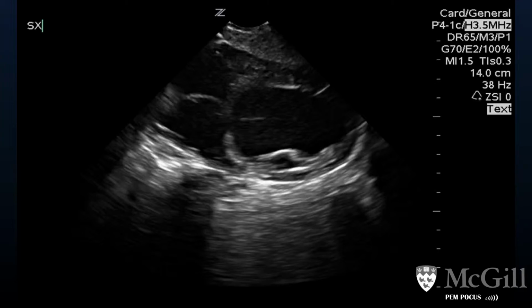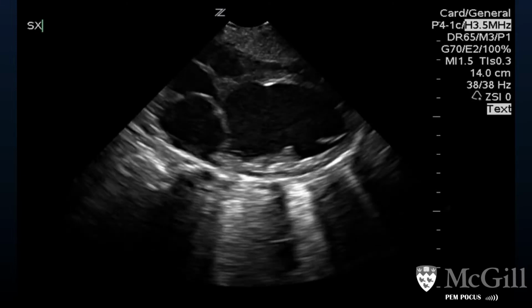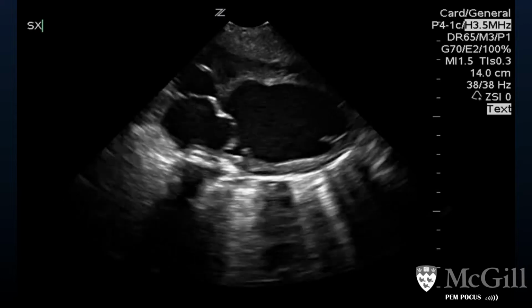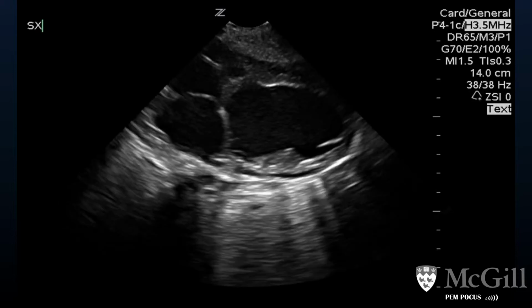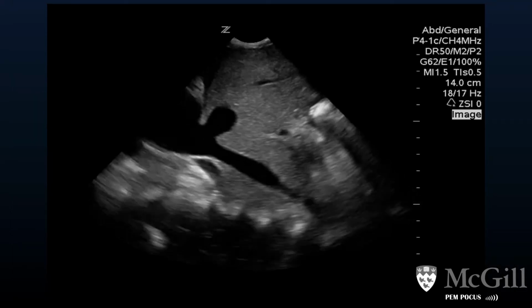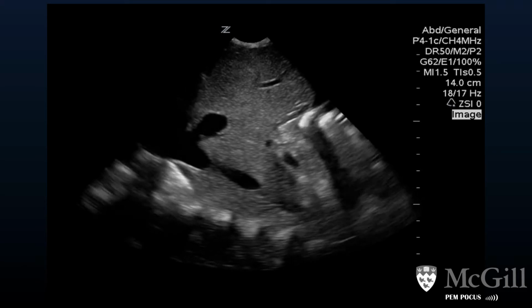You start by performing a cardiac point-of-care ultrasound, and this is what you see. You identified that this patient has poor cardiac function. Here what you can see is a dilated left ventricle with an immobile mitral valve. Upon evaluation of her IVC, you see that her IVC is full and plethoric with a dilated hepatic vein.